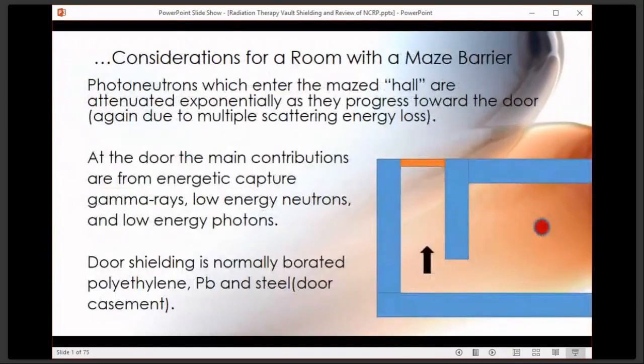So here's the picture, and all kinds of radiations scattered around for low energy beams come down here, but with the high energy beams, the neutrons scatter all over the room and wiggle their way down here, coming from all over the room.